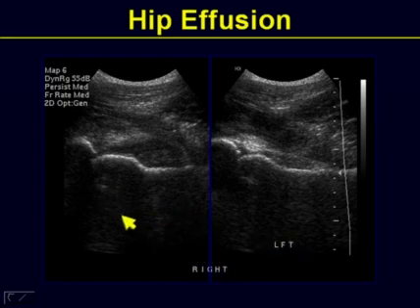In doing so, when you look for hip effusion, left-right comparison is important. Case in point, for example, we already have seen the normal left hip in the normal anatomy we just addressed. And everybody remembers the silhouette of the acetabulum, acetabular labrum, convexity of the femoral head, the subcapital neck part, and the proper neck portion of the femur, and finally into the intertrochanteric region. And of course, the non-distended capsule subjacent to the iliopsoas muscle.